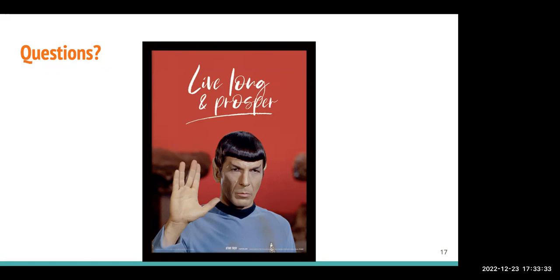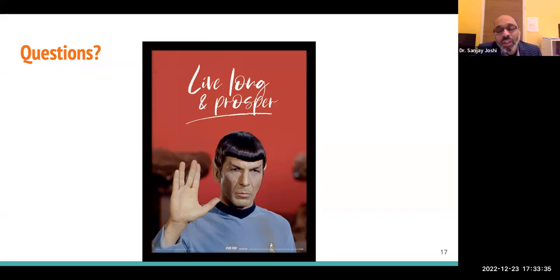What kind of smartphone are they going to use? Are you going to restrict it to tablets, or is it going to be a small form factor phone? Are your buttons large enough for them to use? What about the language interface? So there are a lot of considerations purely from usability from our talk today that apply even from risk analysis.